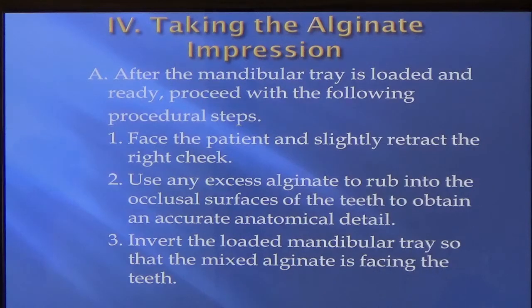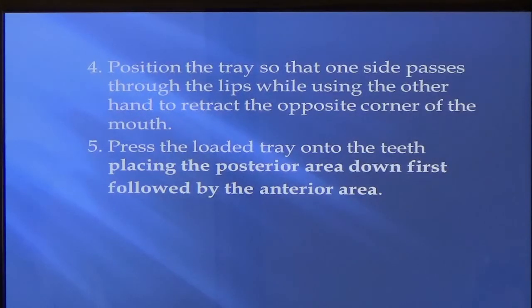Okay, so once you have it loaded on the tray, go to the lab. I'll show you. It's easier to show in the lab what to do. But if you're doing the bottom one, you normally go from the front, and you use the tray itself to spread out the cheek and place it. You tell the patient to lift their tongue up, and then you seat the back, and then you come forward, and I'll show you that. Let's see what else is on the test.